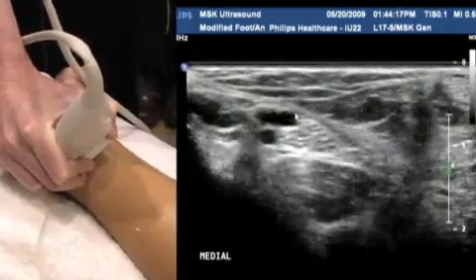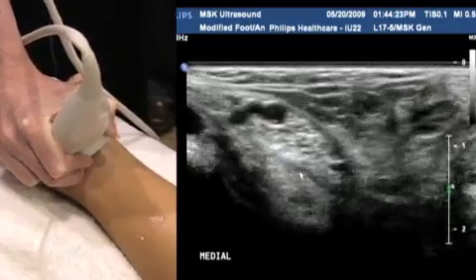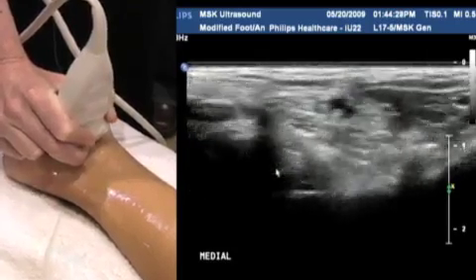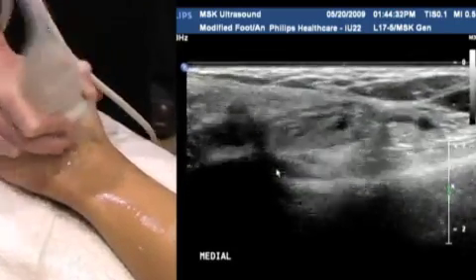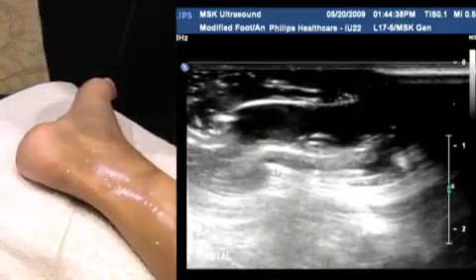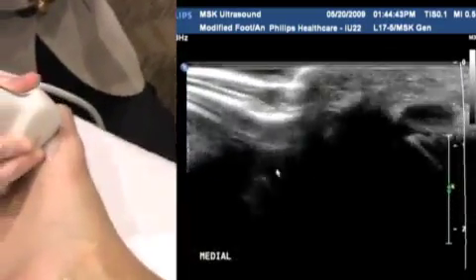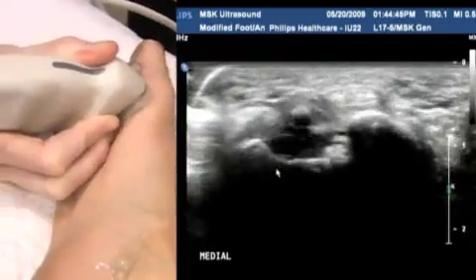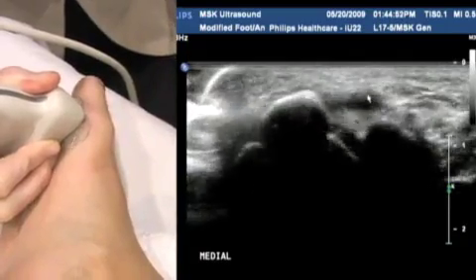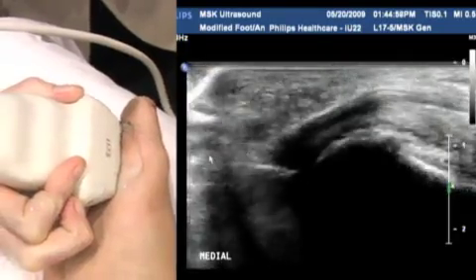We're going to follow flexor hallucis again, heel toeing all the way down through its muscle to the groove here. There it is. All the way underneath the foot. There's flexor hallucis longus, as the name suggests, flexes the big toe. So you need to come all the way down now to the big toe. You can see flexor hallucis here, above the sesamoid, all the way down and attaching onto the big toe distally.